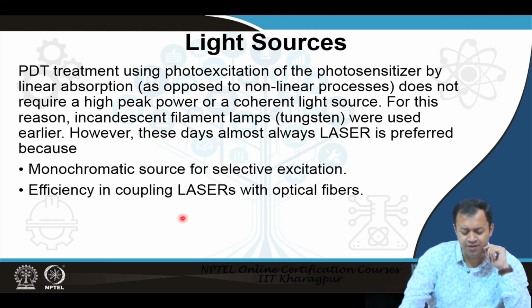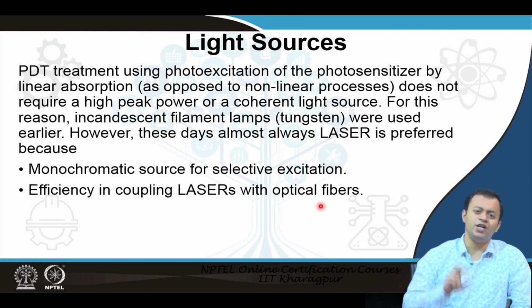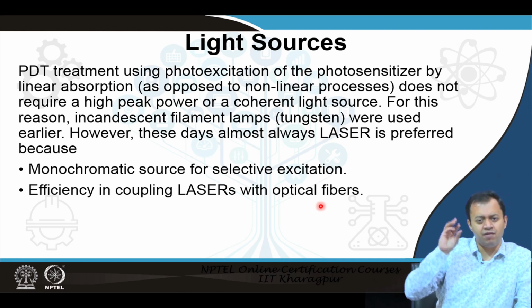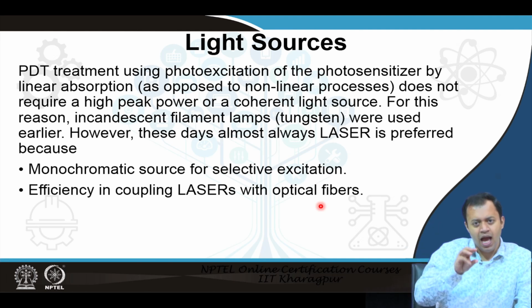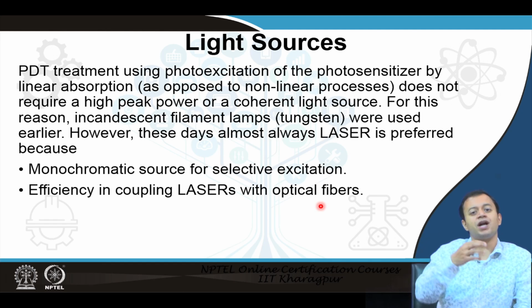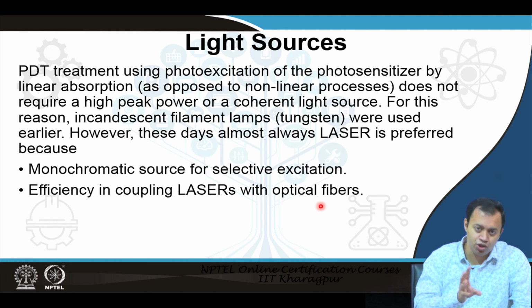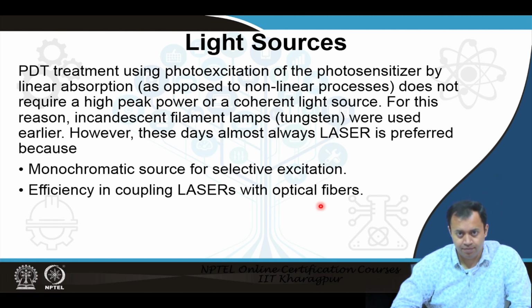Most importantly, lasers are delivered with optical fibers, and with optical fibers you are not only delivering the light; you can put 2 or 3 optical fibers together near the area, and thereby extract some reflected, backscattered light and analyze it to see what exactly is going on, meaning you can monitor the entire process of photodynamic therapy in real time.